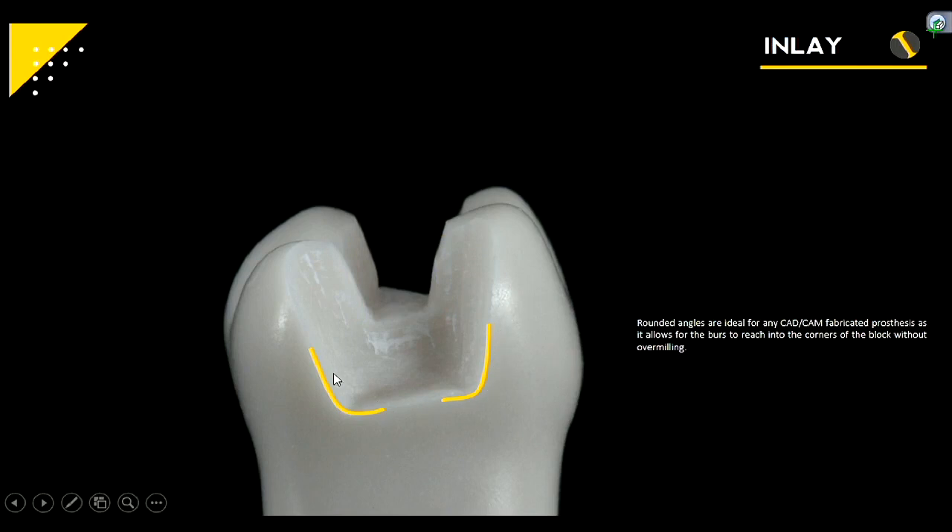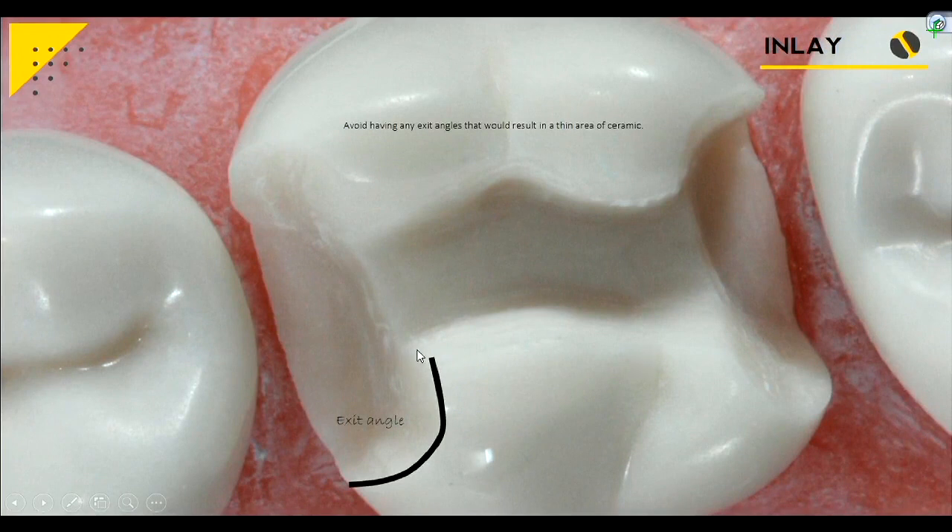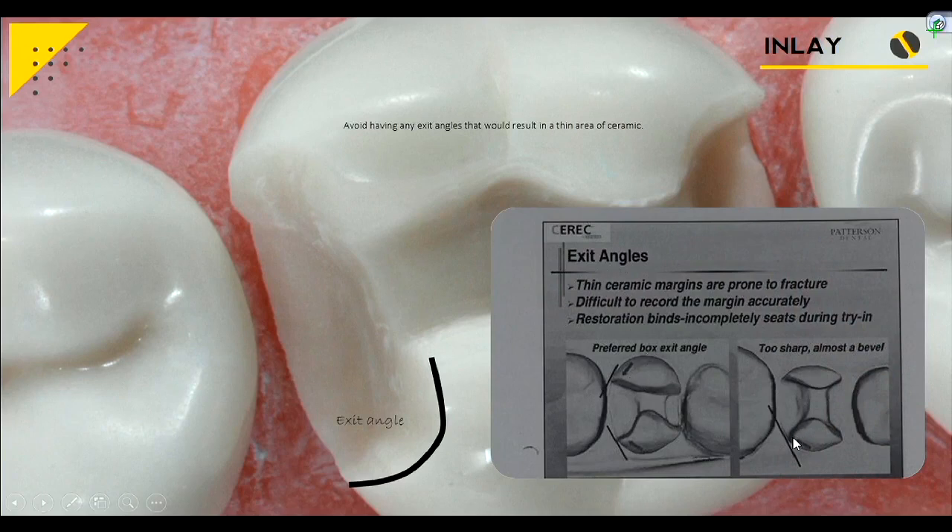Round out your corners as much as you can. Your exit angle is different for ceramic than for gold — gold is really strong even at a thin area, whereas with ceramic you'd rather have a bulk of ceramic at the exit angles. We prefer a boxed exit angle versus something sharp — a butt joint rather than a bevel. When prepping your inlay-onlay, extend these outs wider than you think because you definitely need separation between the teeth. You need at least the tip of that explorer to pass through. Don't be afraid to widen out these boxes to get to this boxed exit angle.